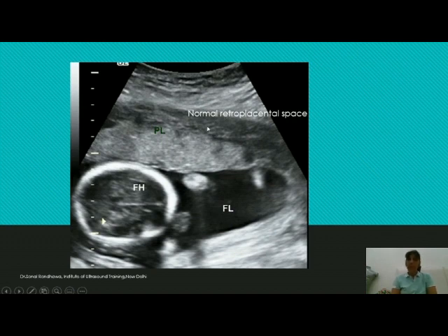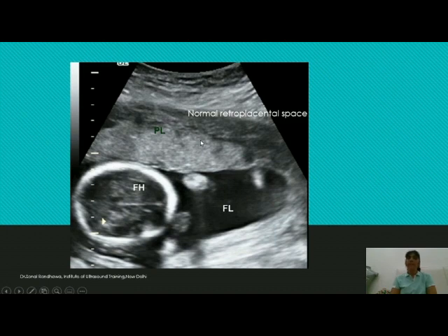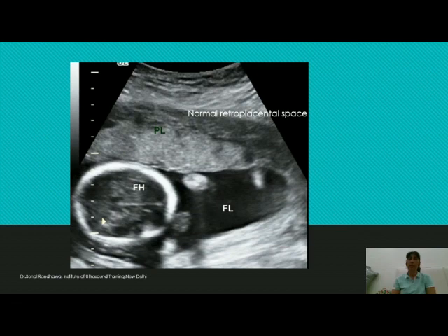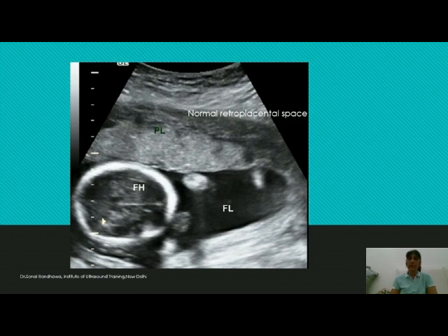You will see this area with multiple white lines running parallel to the placental area. In a normal case, this space is uniformly seen throughout the placental surface — between the myometrium and the placenta. Pay attention to this and trace the whole placenta, observing this area throughout.